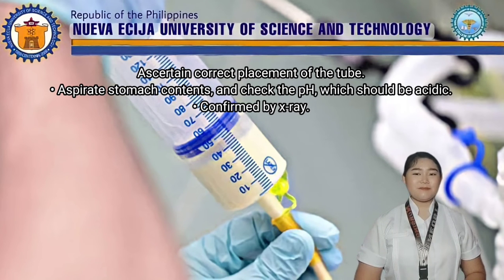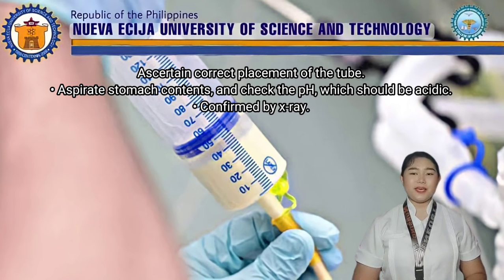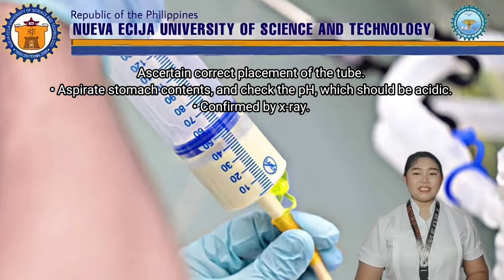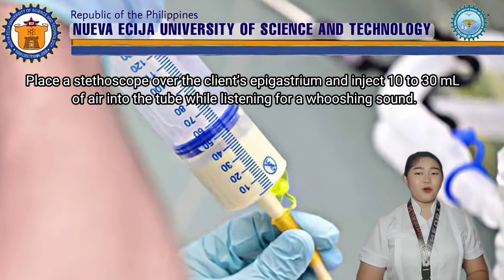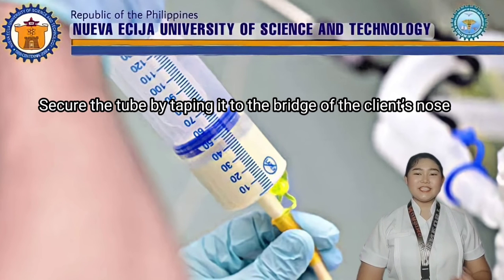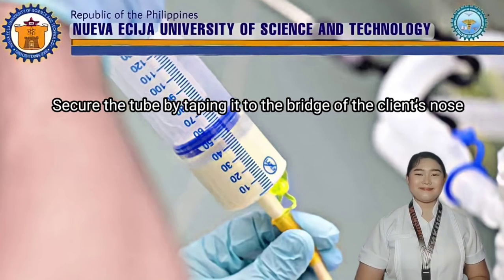Ascertain correct placement of the tube. Aspirate stomach contents and check the pH, which should be acidic. Confirm by X-ray. Place a stethoscope over the client's epigastrium and inject 10 to 30 ml of air into the tube while listening for a whooshing sound. Then secure the tube by taping it to the bridge of the client's nose.